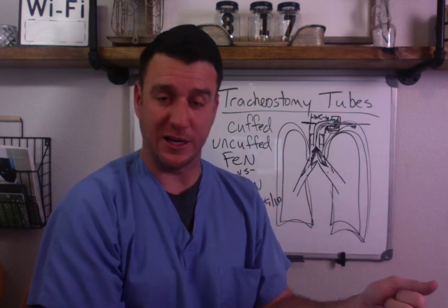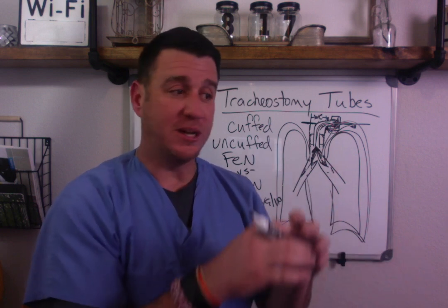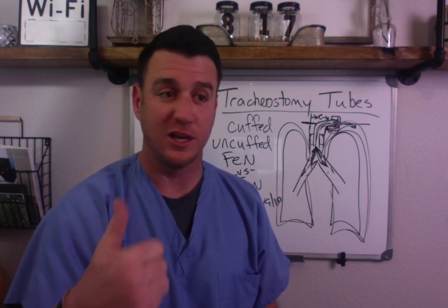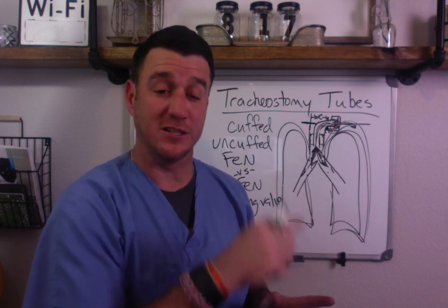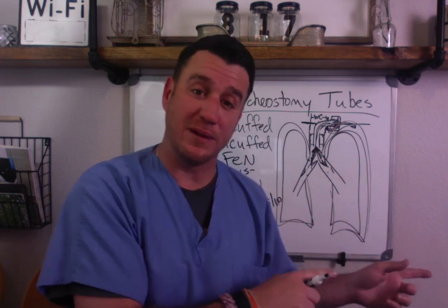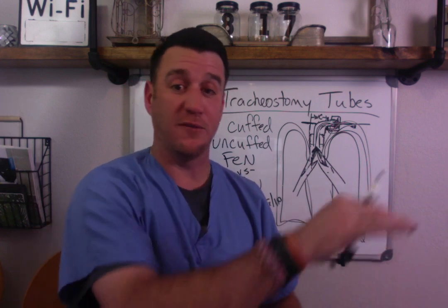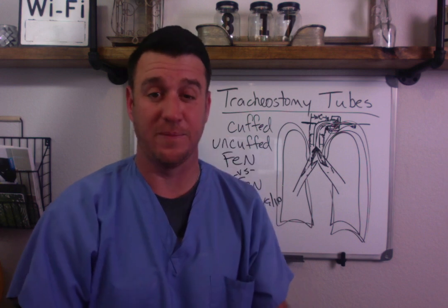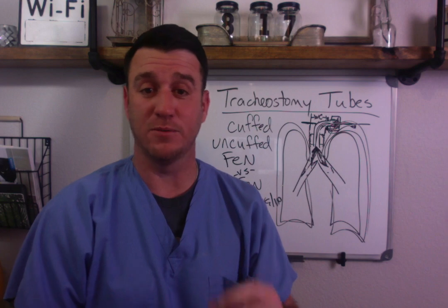Now, you can deflate the cuff, which is what you should do. And that's fine. But you want to be able to relay this information to your care team, to your nurses, to your patient. They need to understand that this cuff is down because the patient's on a speaking valve and it needs to stay down. If the patient needs to go back on mechanical ventilation, then we need to come in, take the speaking valve off, inflate the cuff, and put them back on a ventilator, okay? So do not let that happen to one of your patients. Make sure that you always have your cuff down on a patient wearing a speaking valve.